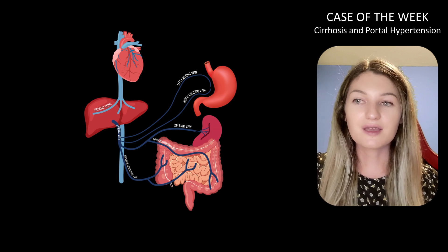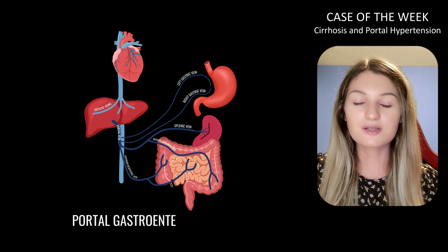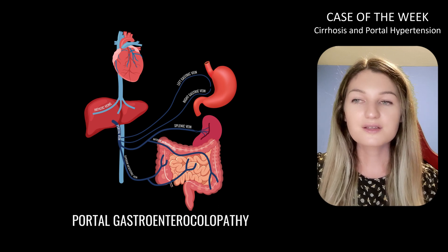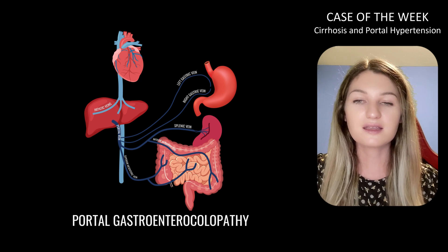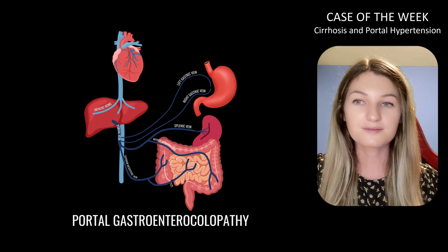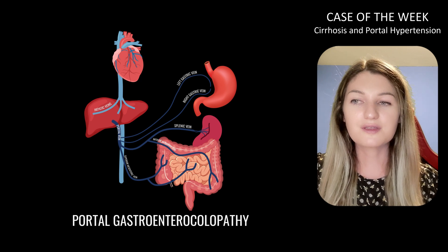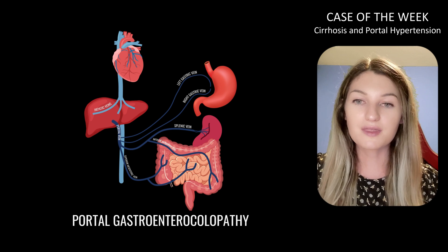Bowel wall thickening and edema is also commonly seen in portal hypertension and is collectively termed portal gastroenteroculopathy. This occurs due to dilatation and increased permeability of the submucosal veins as the pressure gradients in the superior mesenteric vein and inferior mesenteric vein increase. This is important to know so that you don't inadvertently suggest that a patient has acute enteritis or colitis when that might not be the case.